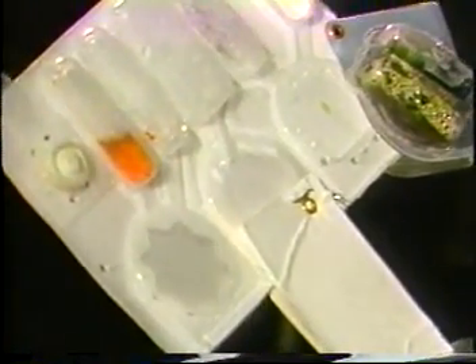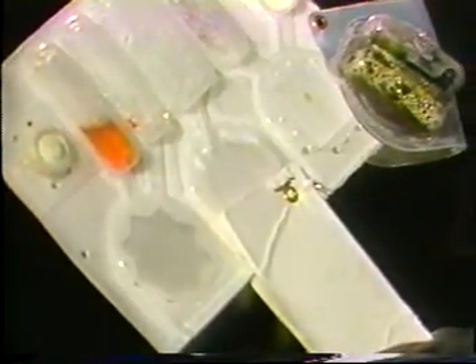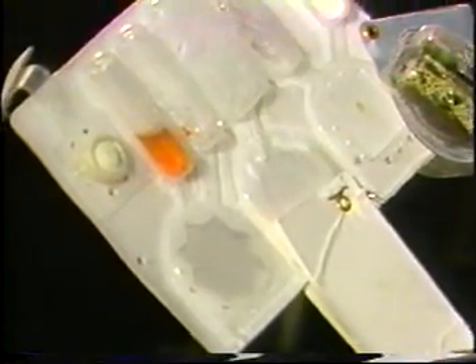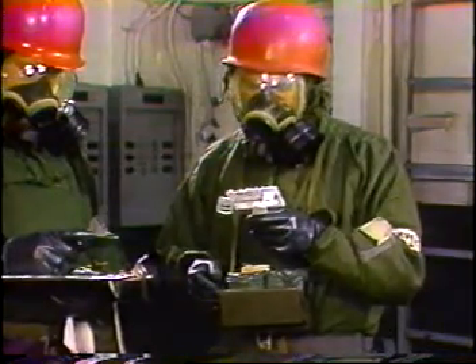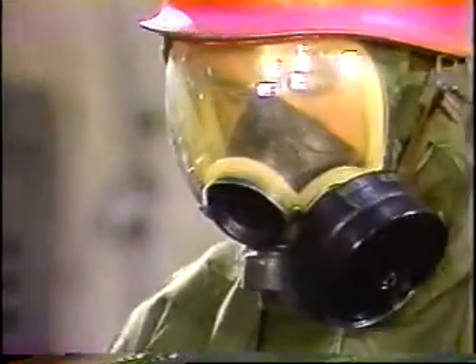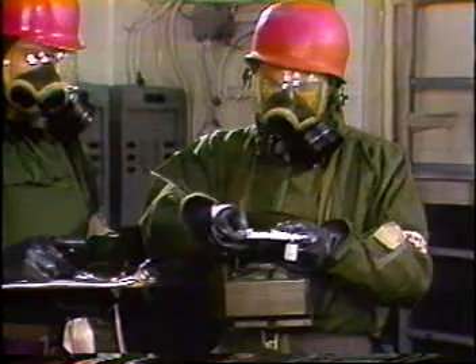Expose the test spots to the air for ten minutes. During this ten-minute time period, shield the sampler detector from direct sunlight and do not place it on the deck or on any surface suspected of contamination. When the ten-minute time period is up, crush the second green number four ampule in the heater and immediately swing the heater into position over the test spot.